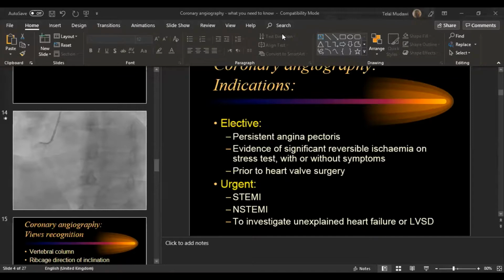لكن في الحالات اللي بيكون فيها البيشنت of average size you feel the puncture, you feel الفيمورال and you can sense clearly انه ده الفيمورال انا شايفه وعارف انه حخش فيه، و you can even compress it على البون ستراكشر تحته بتشوفها بتحسها يعني. في الحاله دي I don't need to necessarily put an artery forceps عشان to puncture، لكن it remains the safest practice انك لو عندك كمان ultrasound عليه يكون added safety. ف this is very valid و very good and I recommend it especially if you are not sure about the puncture or if you can't feel it confidently.